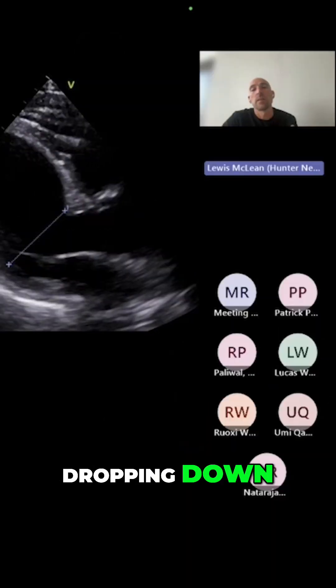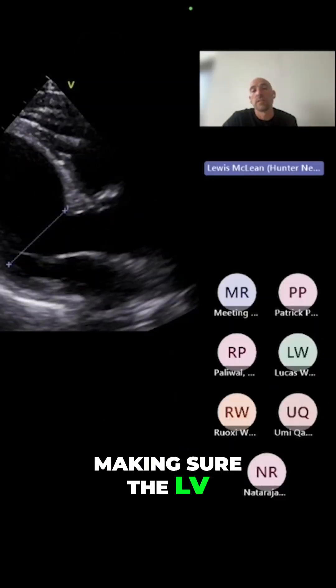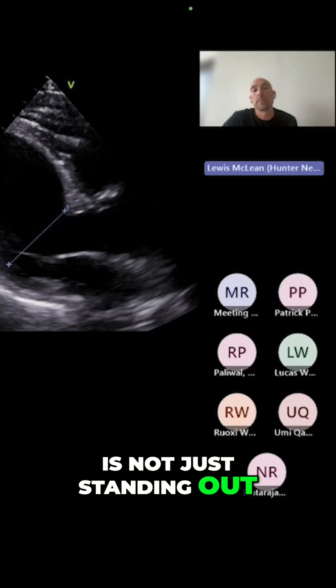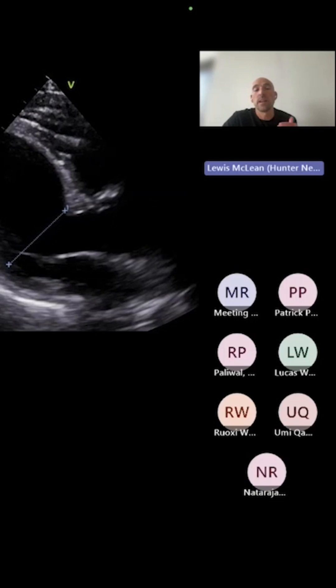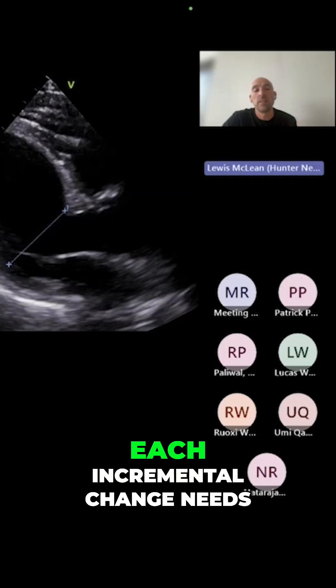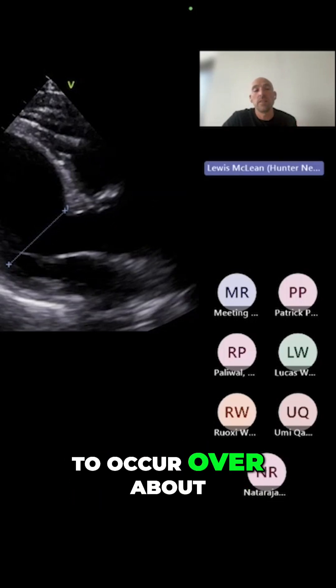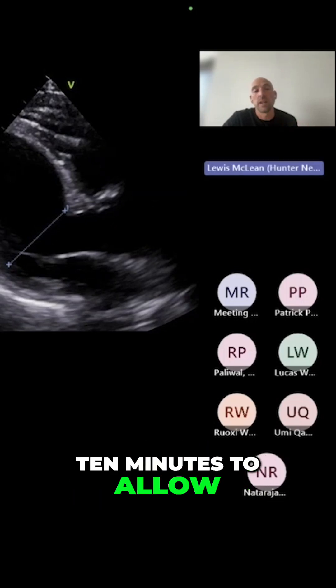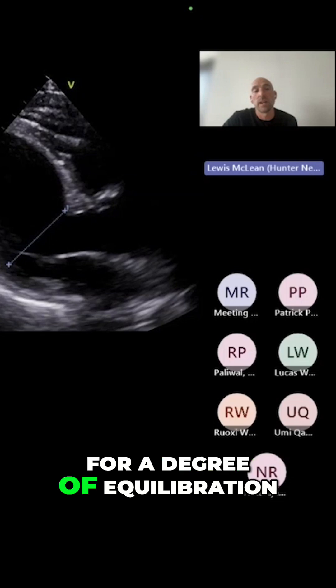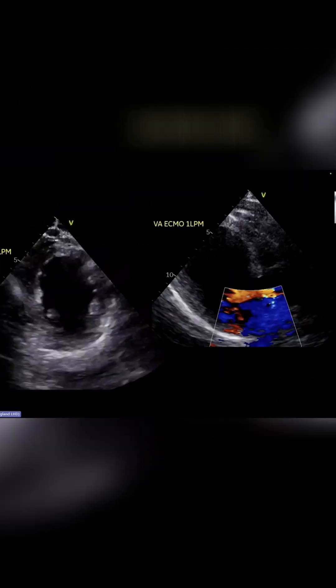Dropping down — making sure the LV is not just standing out. Each incremental change needs to occur over about 10 minutes to allow for a degree of equilibration.